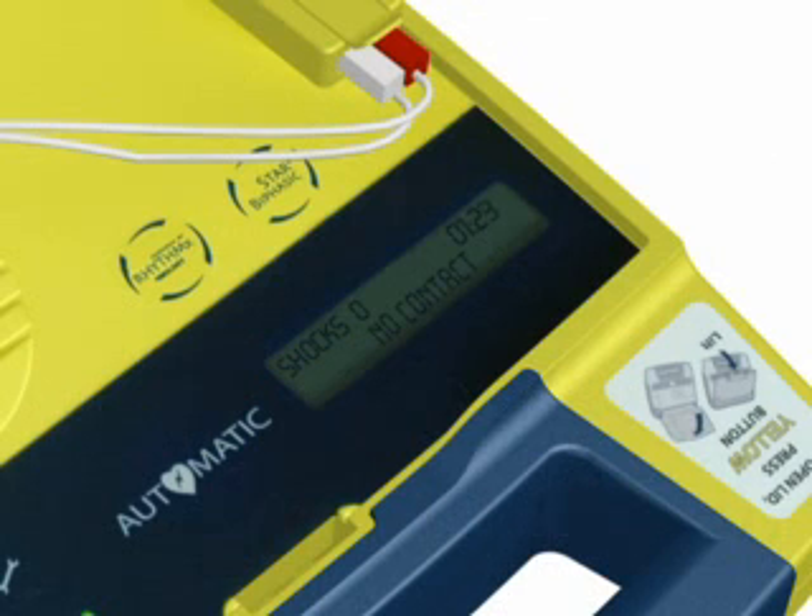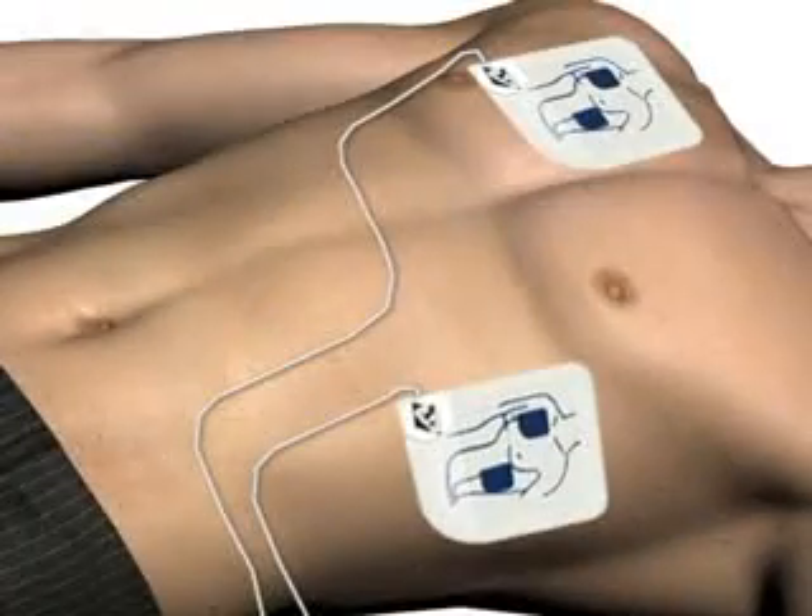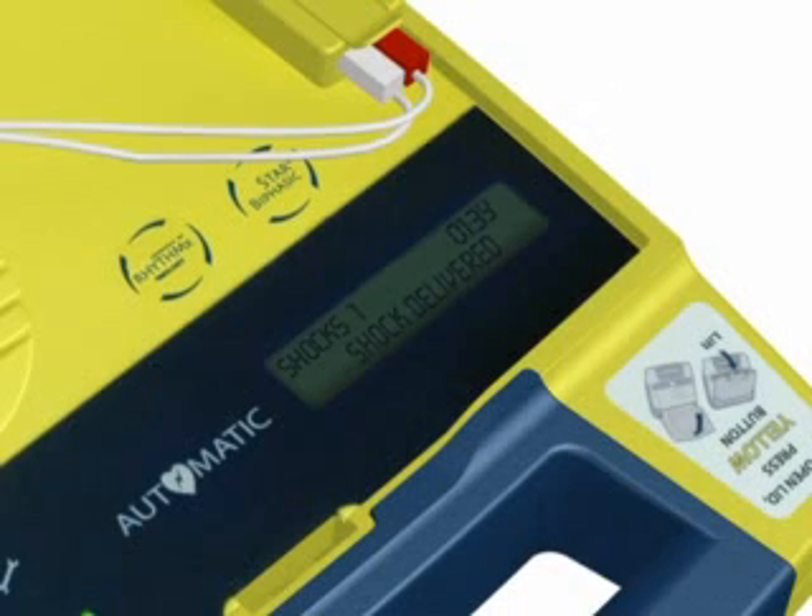Preparing shock. Move away from the patient. Shock will be delivered in 3, 2, 1. Shock delivered.